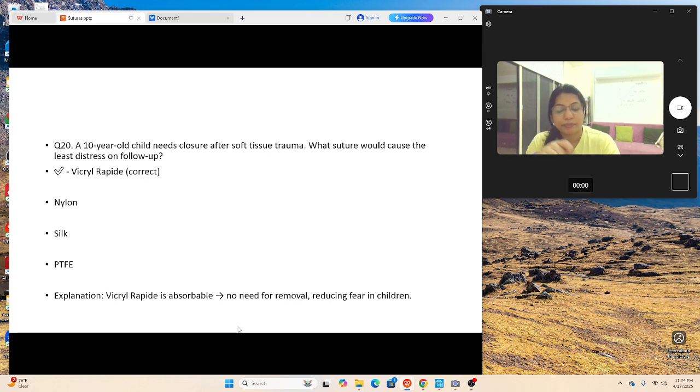So of course, when you do such a big amount of suturing and then the patient comes for follow-up, the last thing you want is to cut the suture and remove that thing off. So if it's just a mucoperiosteum flap, then you can give Vicryl and the healing will take place within 7 to 10 days, and that is enough time for the suture to dissolve.